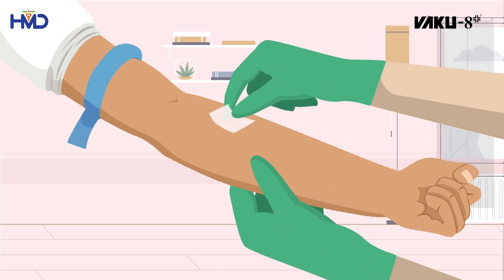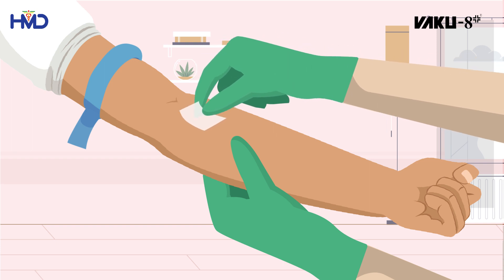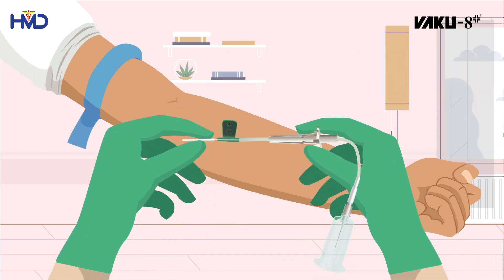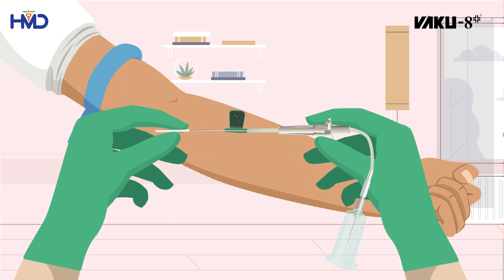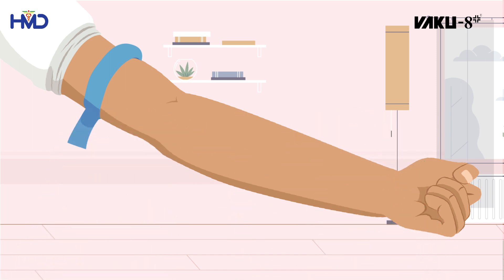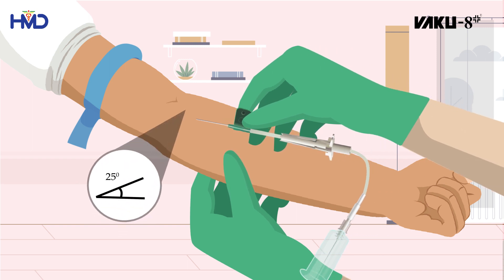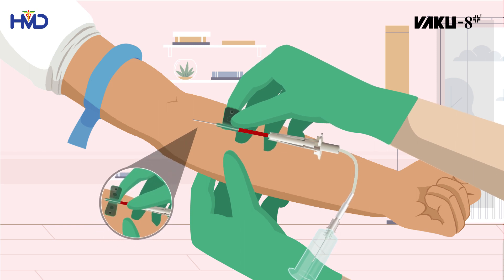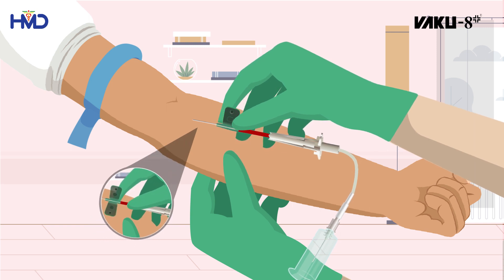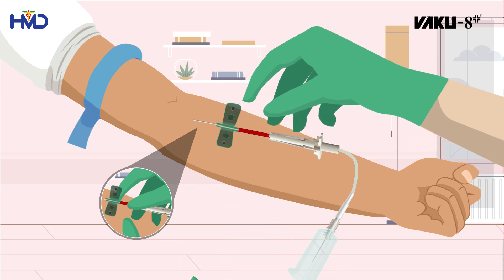Cleanse the site with an alcohol swab and allow it to dry. Remove the needle cap before inserting the needle into the vein. Carefully perform the venipuncture at a 25-degree angle. The rapid blood flashback visualization occurs, ensuring successful cannulation and avoiding cross-perforation of the vein.